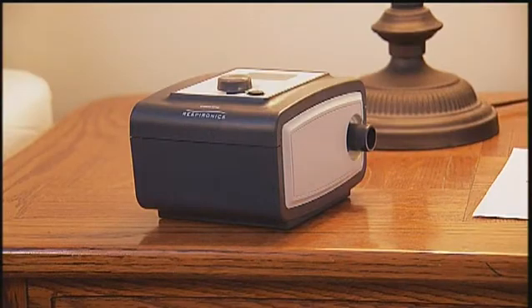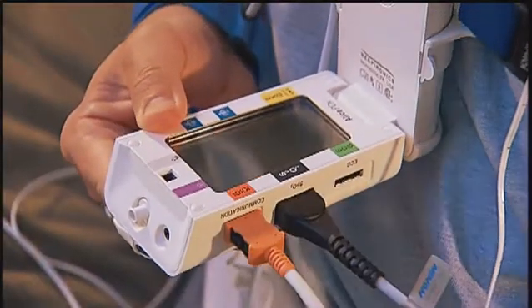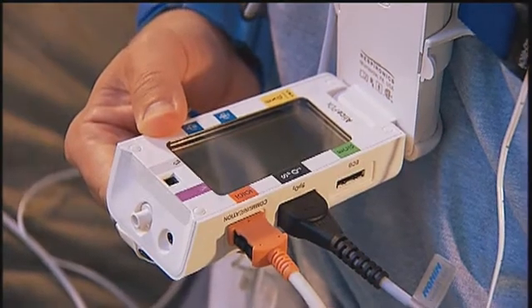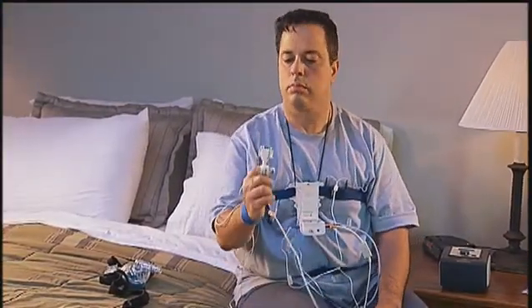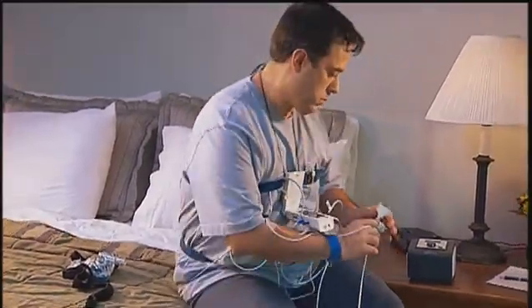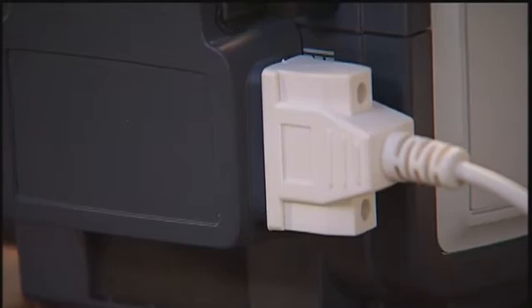If you are using a Philips Respironics therapy device that looks like the one shown here, connect the orange end of the therapy device cable to the port next to the orange color-coded area on the Alice PDX. On the other end of the cable, connect the white serial cable connection to the black connection port on the back of the therapy device. This will enable the Alice PDX to record data from your therapy device while you sleep.